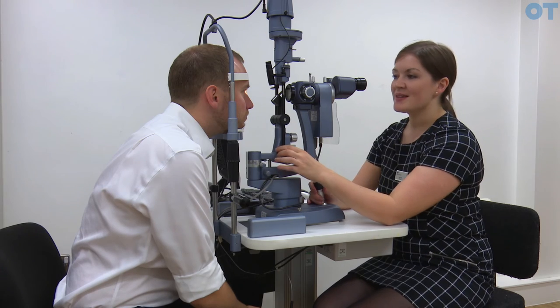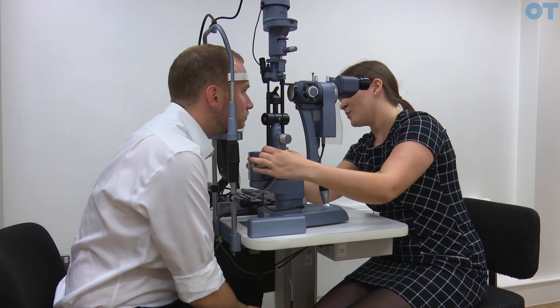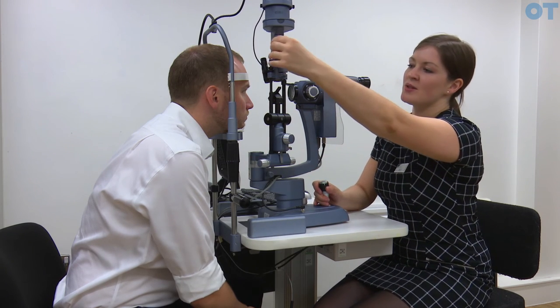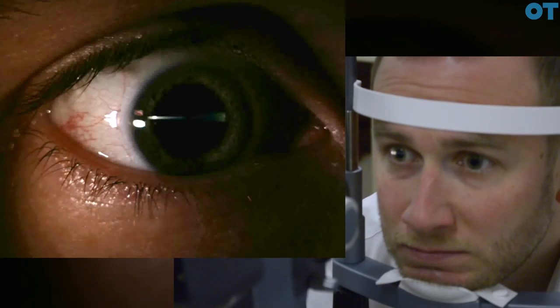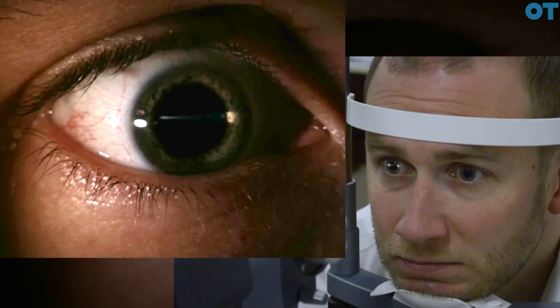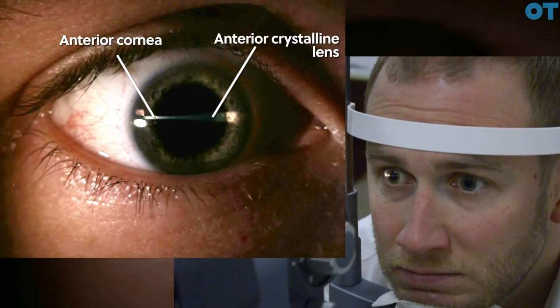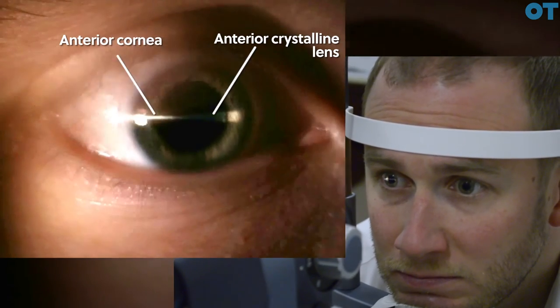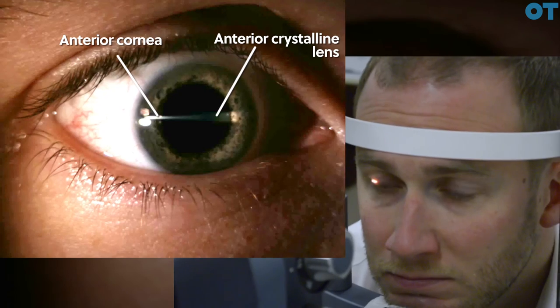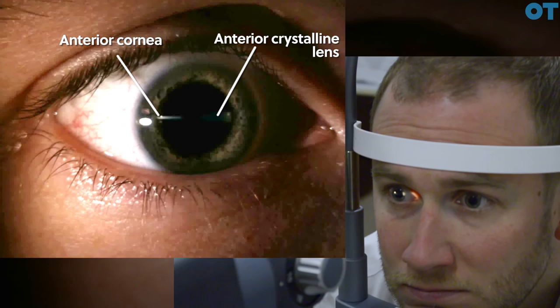In order to perform Smith's technique, the observation and illumination systems must also be separated by 60 degrees and the beam must be rotated so it is horizontal. You place the beam horizontally across the cornea. Starting with a short beam, you will see a brighter beam placed on the anterior cornea — the epithelial surface — and then a duller image placed on the surface of the anterior crystalline lens.